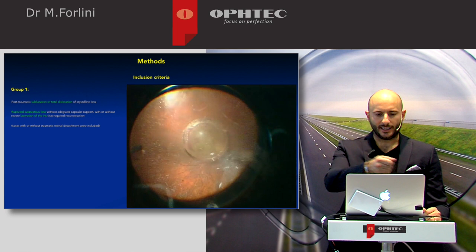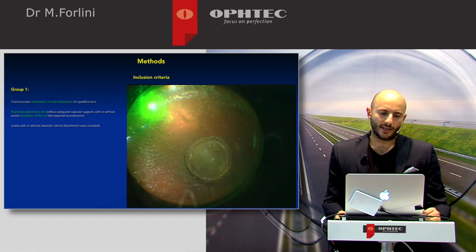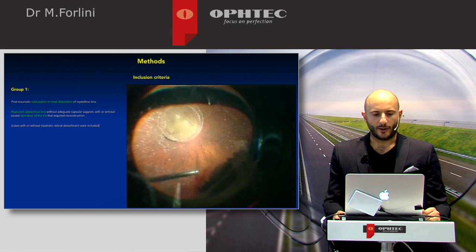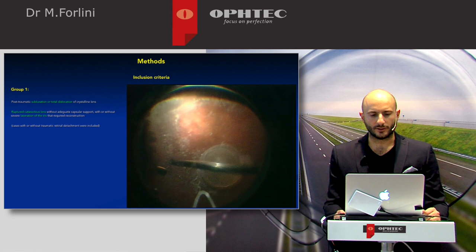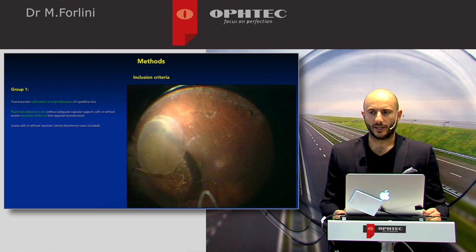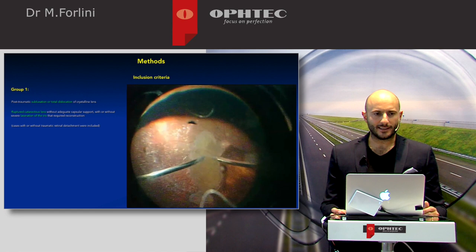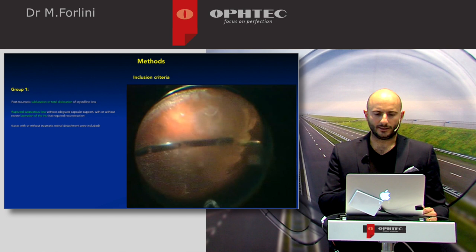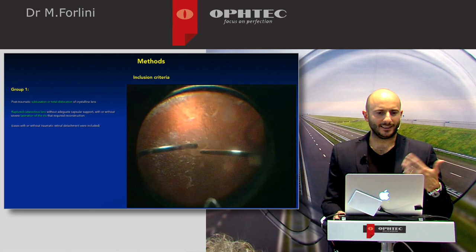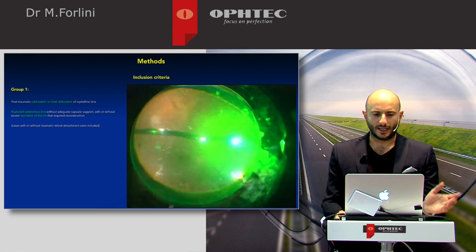We completed the peripheral vitrectomy with shaving of the vitreous base. A lot of laser was applied because the break was almost 180 degrees. We then focused on the crystalline lens — the lens was quite soft because the patient was young, so we could remove the lens with the vitrectomy probe using 23-gauge. We just used the vitrectomy machine and did not need phaco. The lens was completely removed, and we finished the endolaser for 360 degrees.